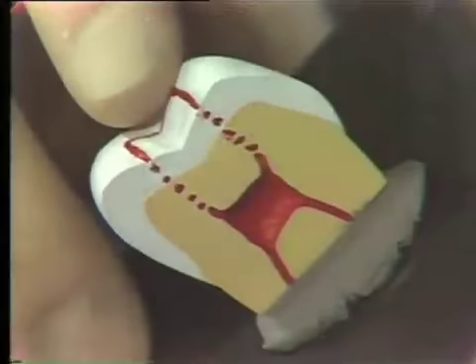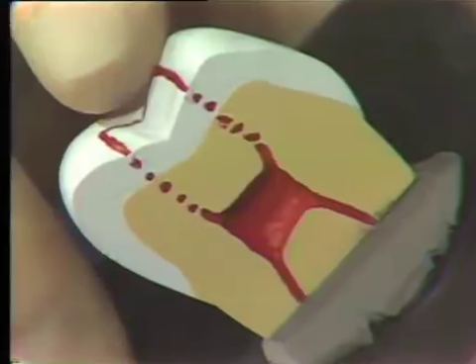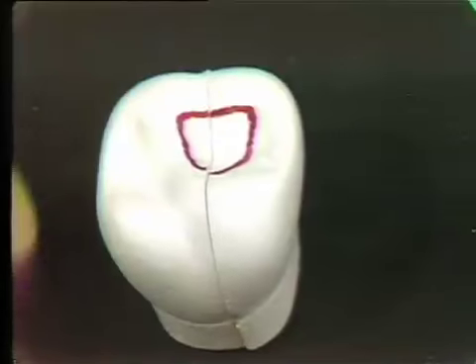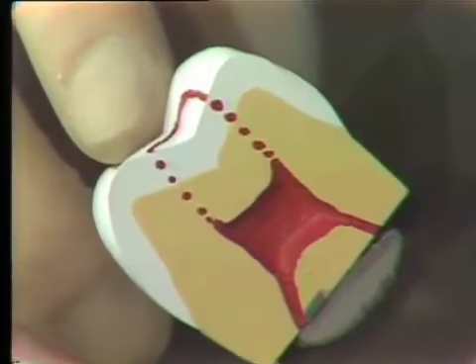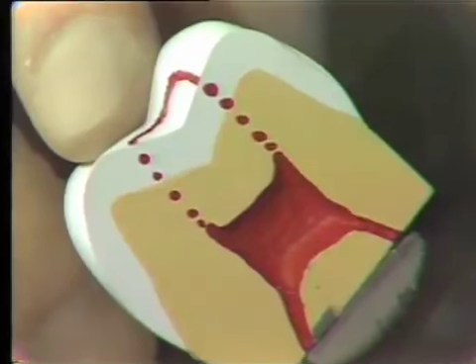Once again, if we open this tooth up, you can see that this corresponds with the roof of the pulp chamber. And finally, the maxillary molar. With the outline form of the pulp, we open the tooth up. This is the roof of the pulp chamber that we want to remove, and we'll have access to all of the pulp chamber and the canals.